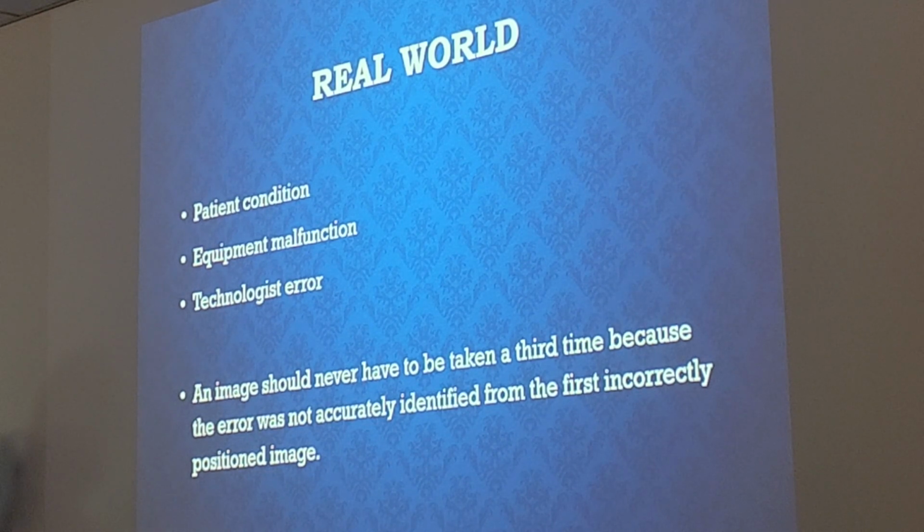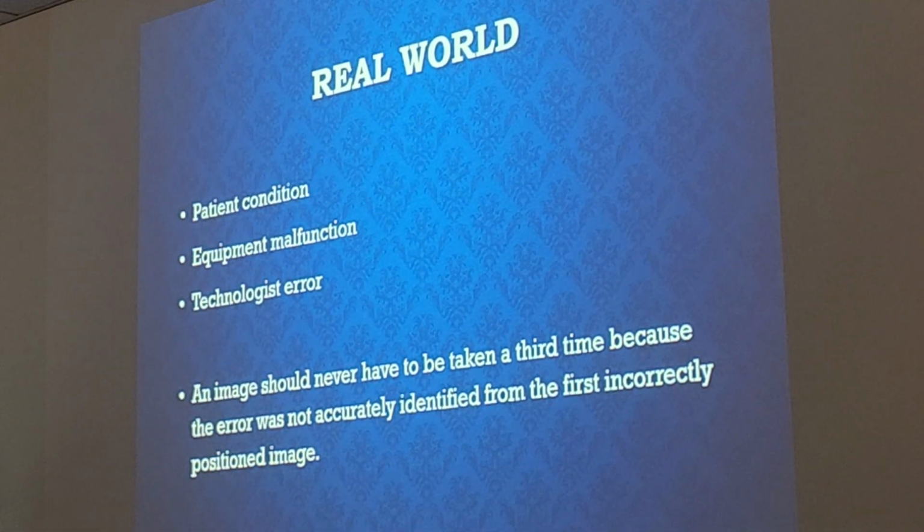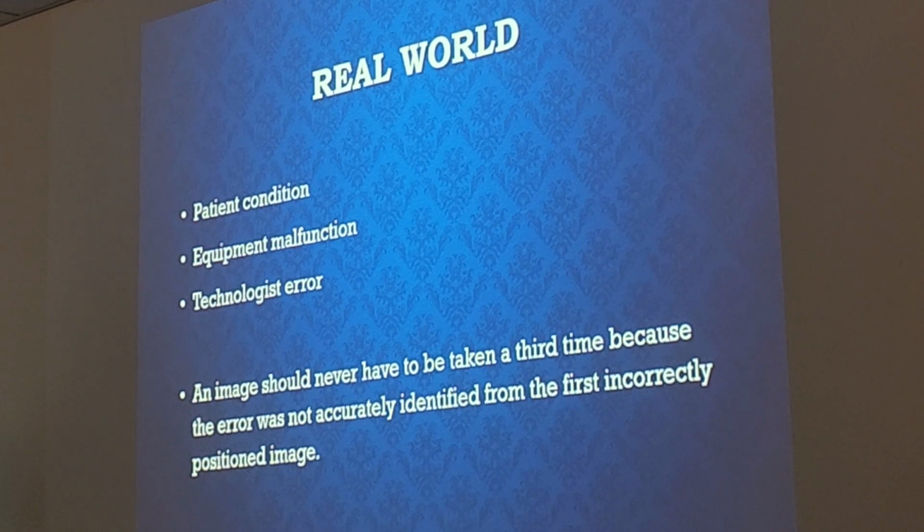But you shouldn't have to be taking images 3, 4, 5 times because you didn't do your due diligence and check the patient, right? But let's say for a lateral wrist they have a funky radius, you're trying to get a perfect lateral, but something is off, or overexposed. When would you stop, at 3 or just after the second? If it's strictly something to do with the patient positioning, maybe stop at 3. What do you think, Mr. Kwan?